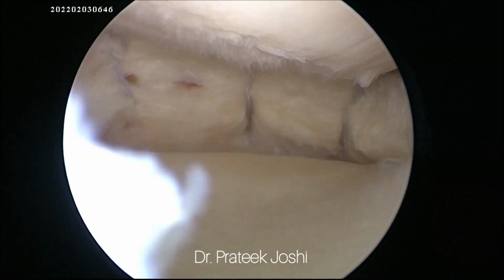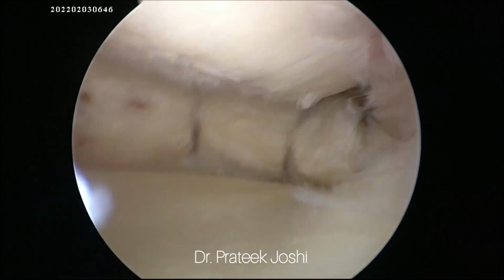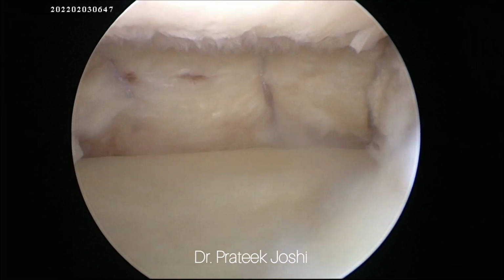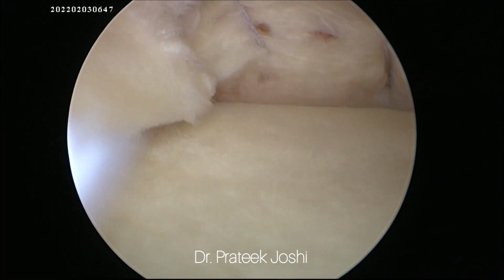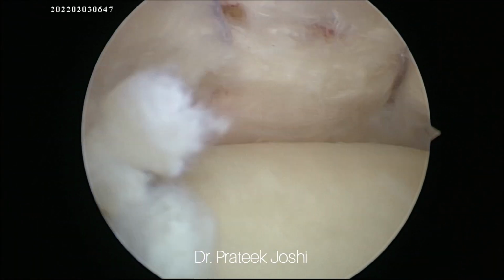And this surgery is going to provide a few more years to the knee joint of this patient, and the patient might not require knee replacement surgery for many years now. And obviously the symptoms with which the patient presented to us are going to be taken care of with the help of the mucoid degeneration ACL debulking and the meniscus repair that we have done.